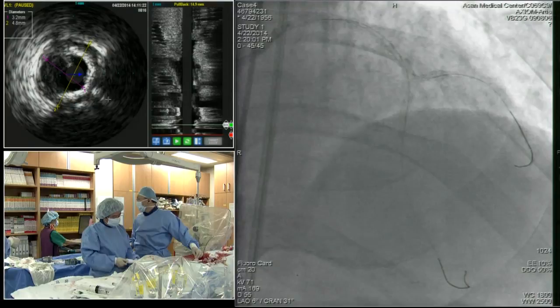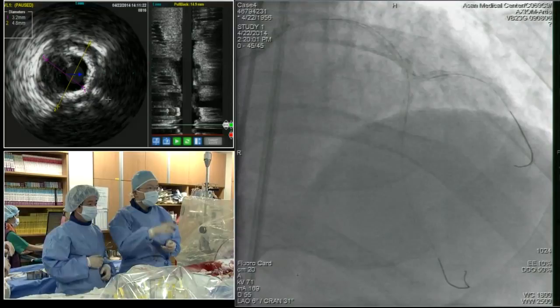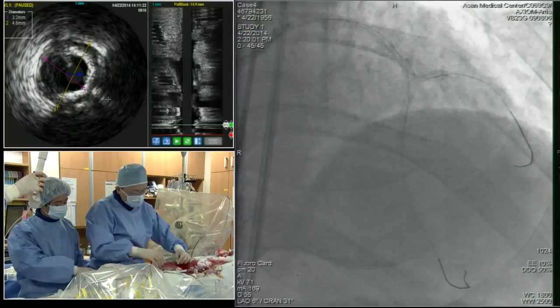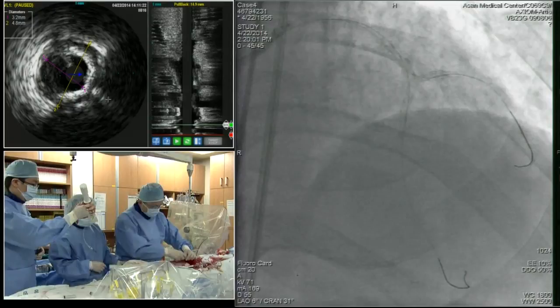1.5, 10. Because it is good. But anyway, I don't want to destroy the structure of Promus stent, nor do anything to disrupt the LAD stent. But I'm not sure whether after Corsair this balloon can pass. This is new 1.5, 10. Okay, there's a trap.